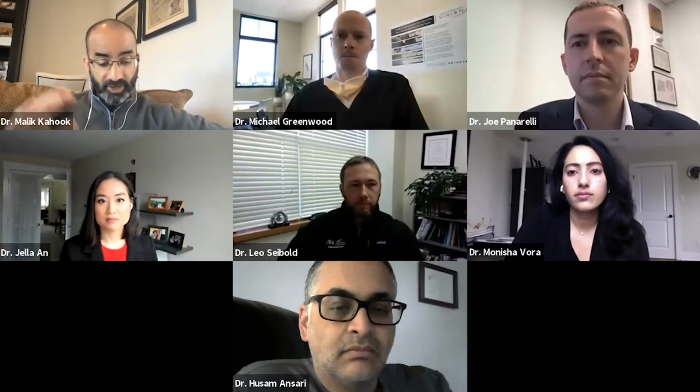I have a series of questions. We're going to try and go for about 25, 30 minutes with some of the questions that have come in from the audience members, and this is really in no particular order. It might be good to just go through the panel and get an idea. Common question is, what kind of gonio lens do we use? Starts with Mike Greenwood. The question actually came in with the gonio lens you were using, which I believe is from Glaukos. Is that right?